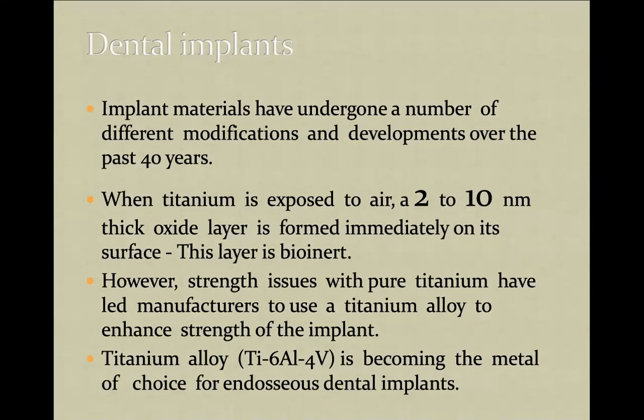At the same time, the dental implants will undergo mechanical loading that is the result of the mastication process. So the mechanical features of the dental implants are very important. Again, in the lecture, I'm going to explain what kind of complications might occur.